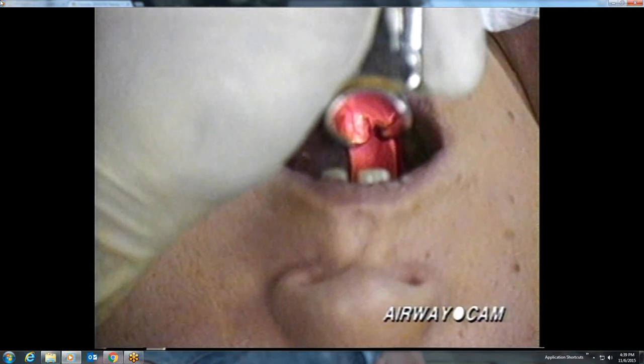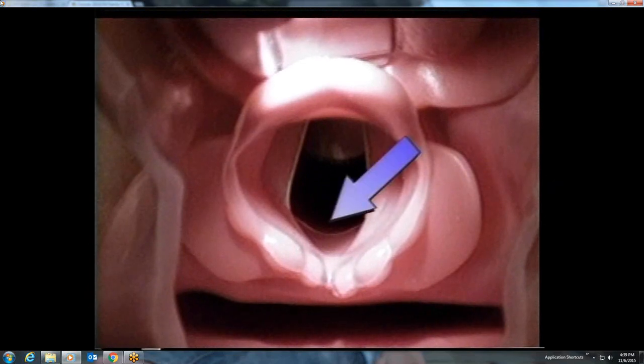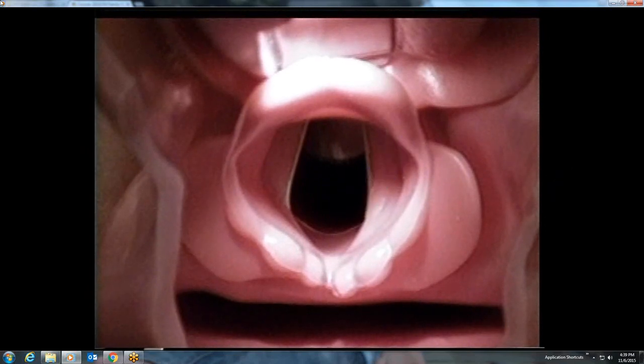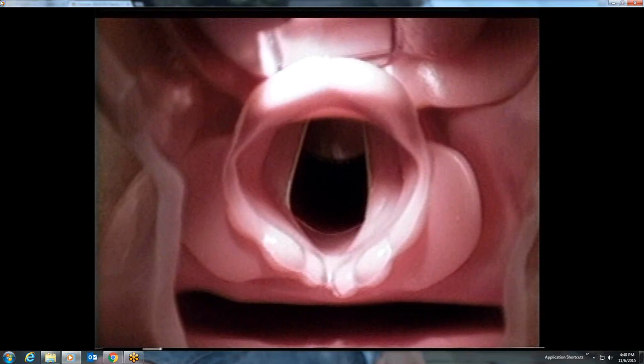Following visualization of the posterior pharynx, one of two critical landmarks should come into view: either the epiglottis or the posterior cartilages. Note that above the posterior cartilages and interarytenoid notch is the entrance into the larynx. Below the posterior cartilages is the esophagus. If the true vocal cords are not visualized, directing the endotracheal tube anterior to these landmarks will ensure endotracheal placement.